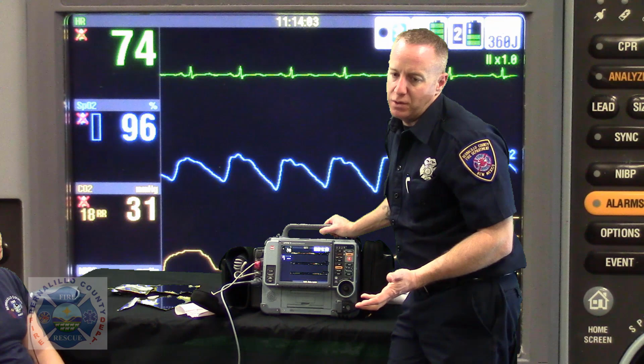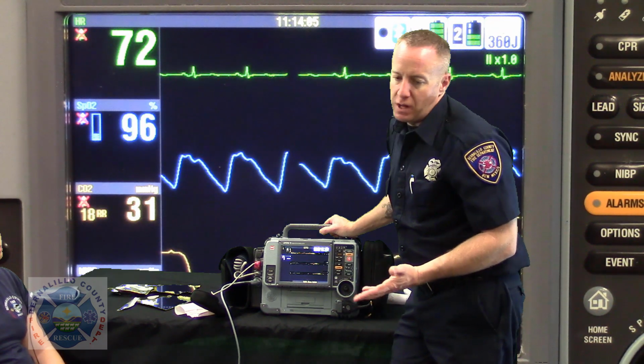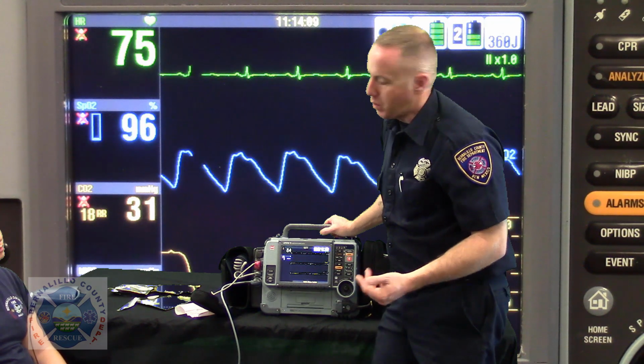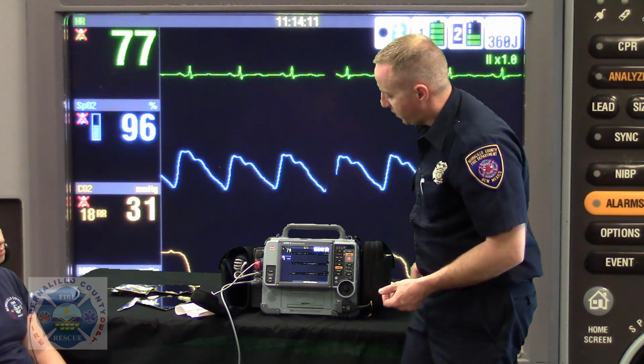We'll be leaving here and see you in about 20 minutes. And then follow up with them if the patient's clinical picture warrants it. So that's 12-lead EKG.